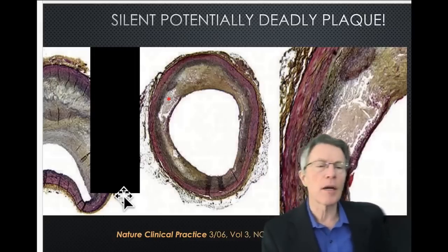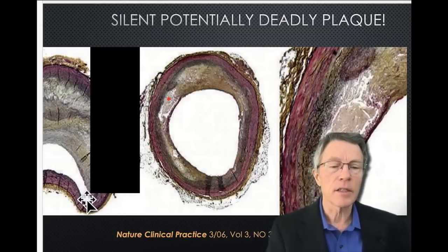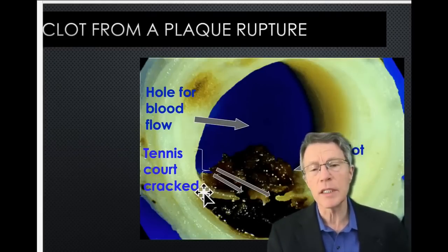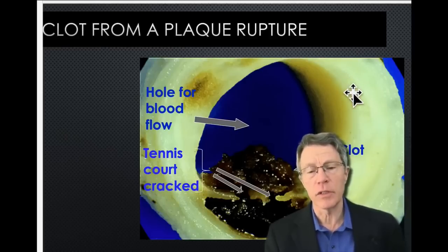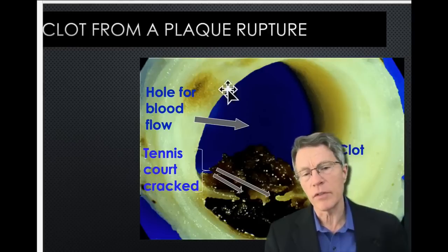Now, back to the question about perspective and some of the difficulties in getting a CIMT. Look at this. In this one, you've got this much plaque on this side of the artery wall. On this one, just 180 degrees over, you have very little plaque. So, again, it's critical when you're looking to measure an age or estimate an age that you have the right number. As you start looking at this biological gross specimen from someone that died due to this plaque breaking out, you begin to realize that if the view comes through here on the ultrasound, they're going to get a very different perspective than if the ultrasound's coming through here.